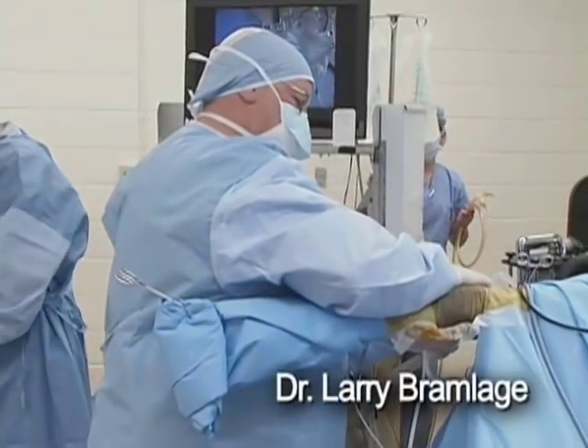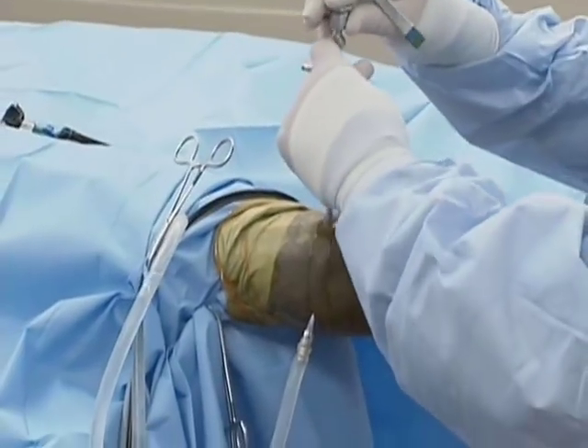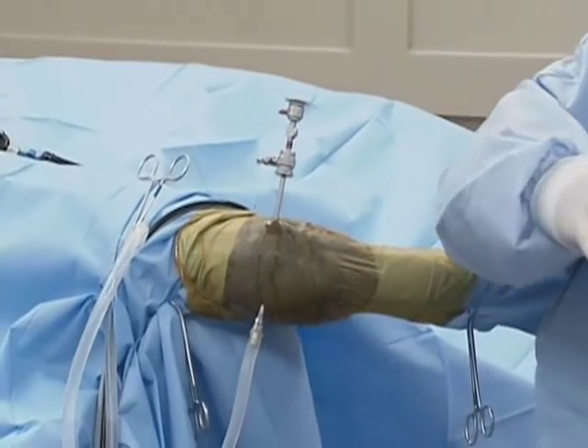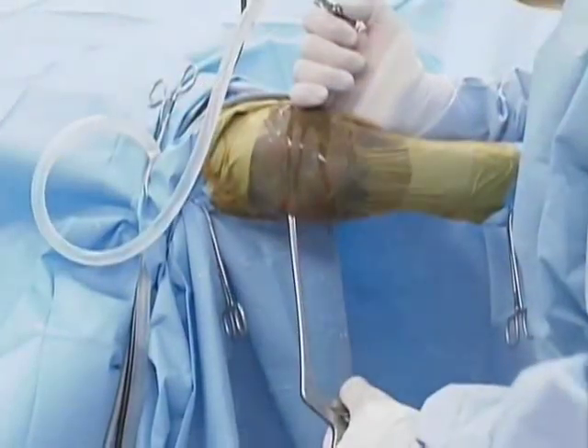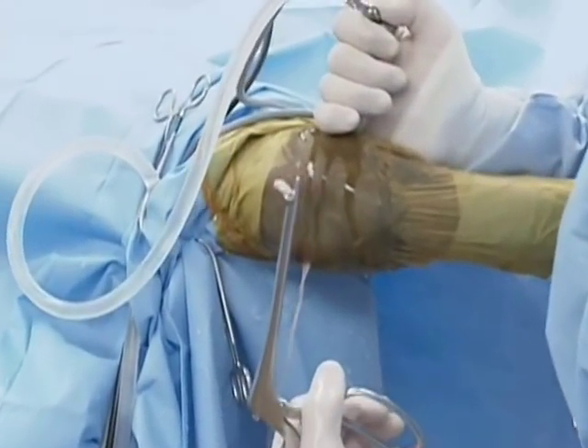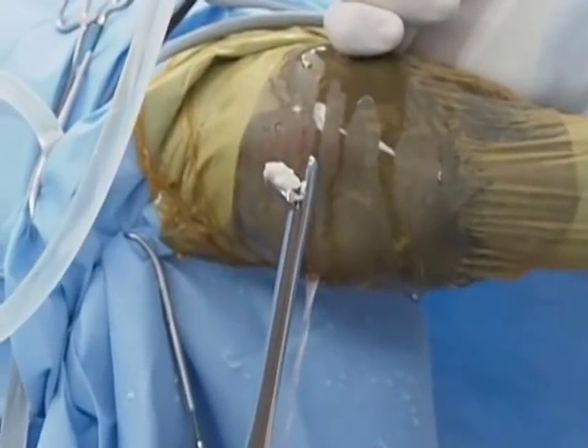I need to make a small hole, about a quarter of an inch, so that I can insert the protector for the arthroscope. He has several sites where he has small fragments, so I'll get them out first. This is a fragment of bone that was inside of his joint.